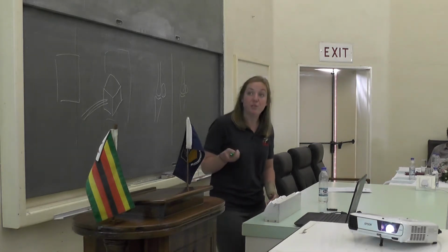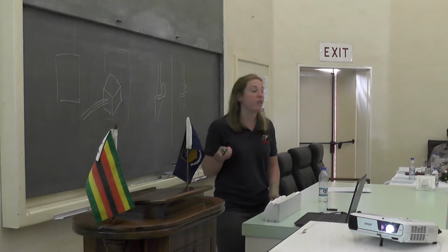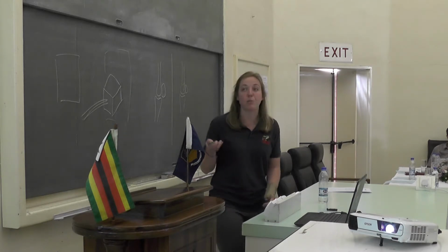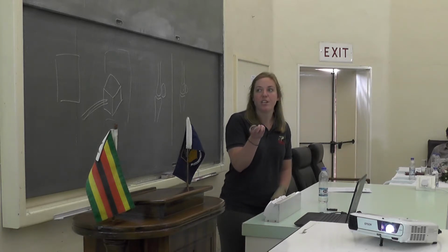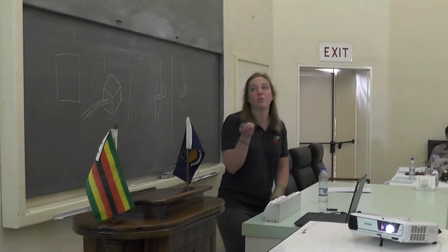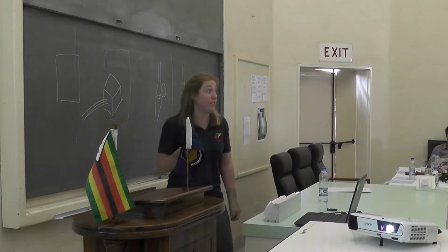And you can use this same projection with centering and collimating at different levels to focus either on the third phalanx, like we've spoken about, or you can narrow your collimation, change the settings, and focus on your navicular bone, which is superimposed, but it's all here nonetheless. So this is one of the views as well that you can use for the navicular bone.